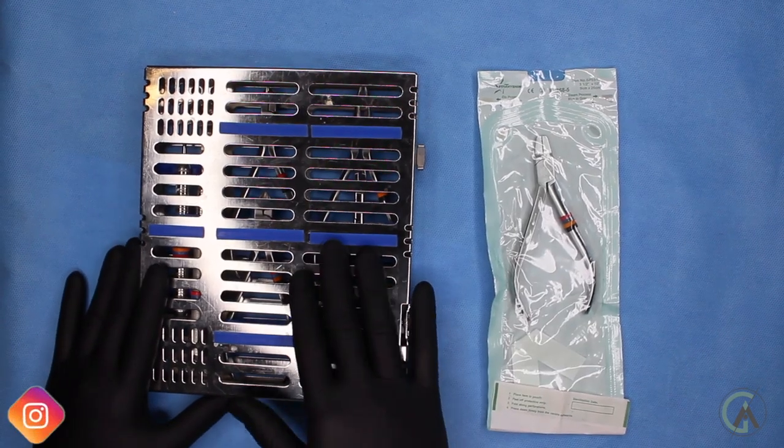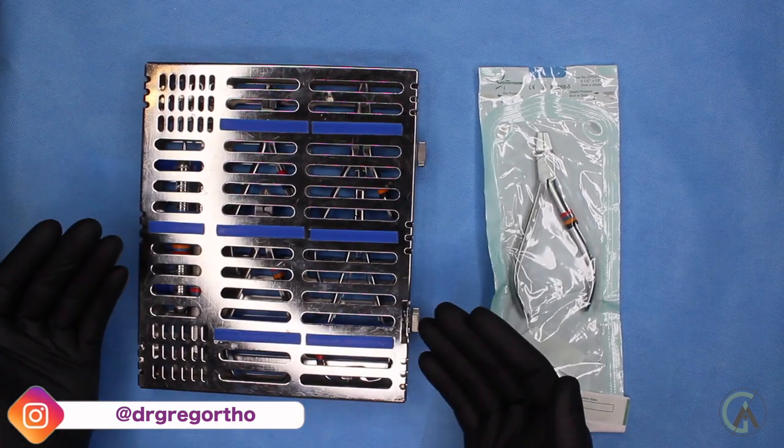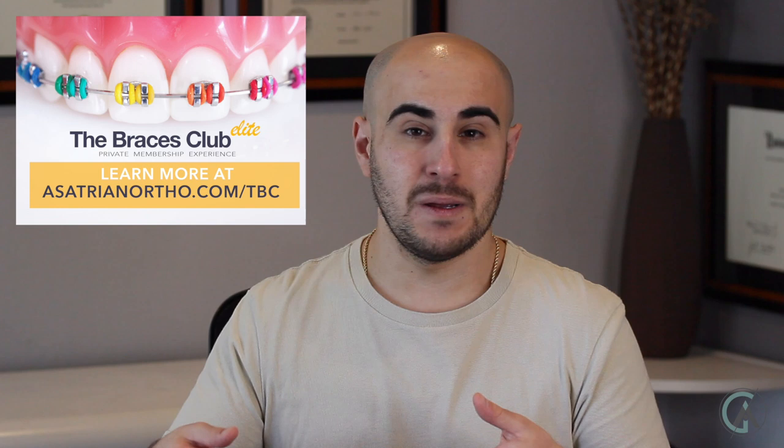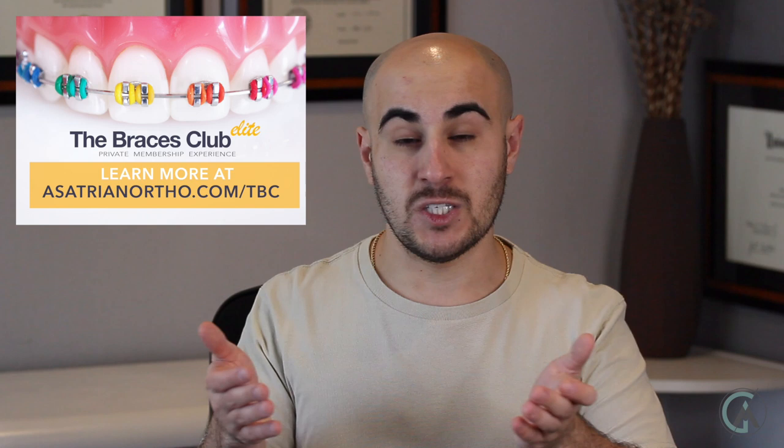This is what an orthodontic cassette is, and this is what we can use to store some of our instruments so that they don't bang up against one another once they're in the autoclave. You might notice that your orthodontist uses a cassette like what I'm showing in today's video or just a simple baggie — this is just a preference of the orthodontist. If you put them into the cassettes, that costs a little bit more, but it makes the instruments last longer. It's really just a trade-off whether you want to buy more instruments or invest a little bit more and buy a cassette that protects the instruments during the autoclaving process.